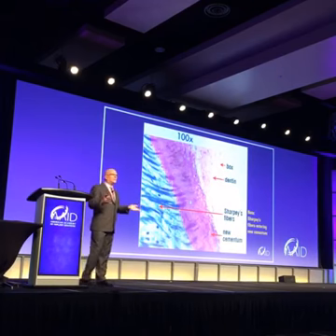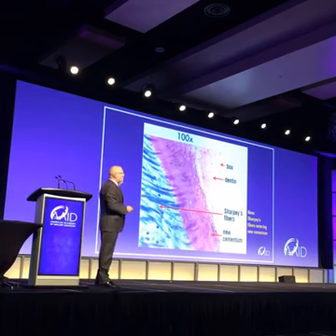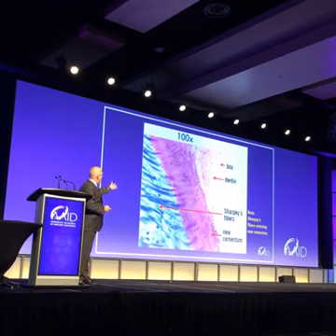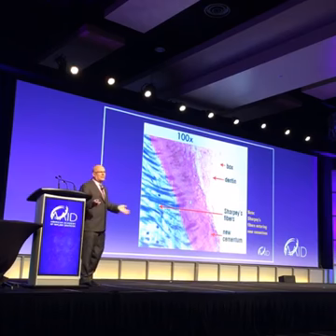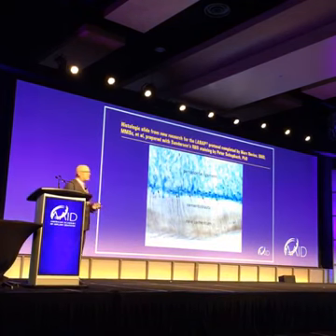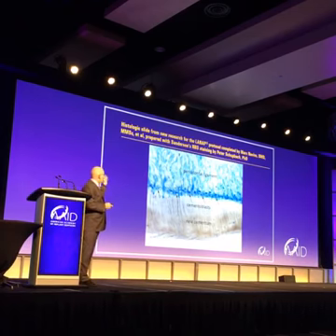We're getting a brand new PDL showing up exactly as it should look in the mouth. And you have new cementum, we have dentin, and that's it. So we have regeneration at the histological level. And this is just another slide showing it again: the periodontal ligament fibers directly inserting in the correct orientation into the new cementum. It happens.